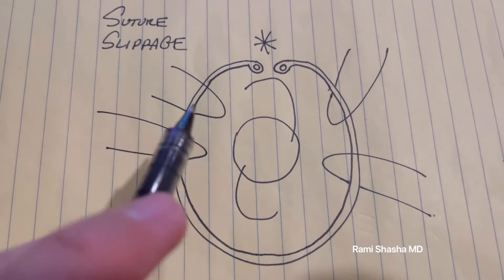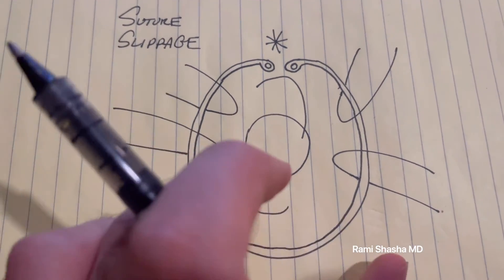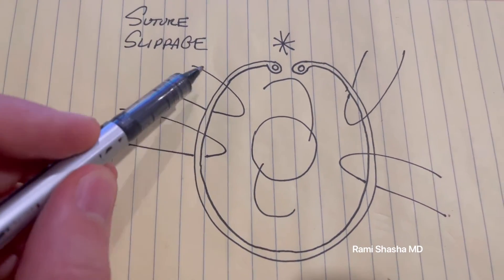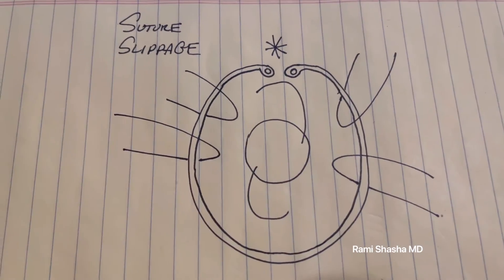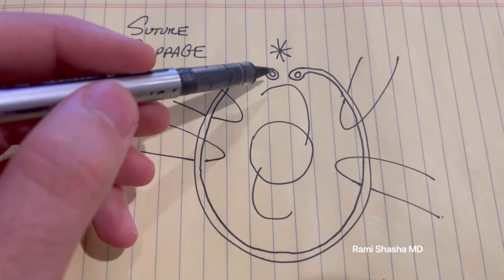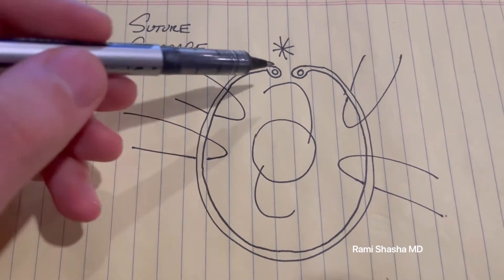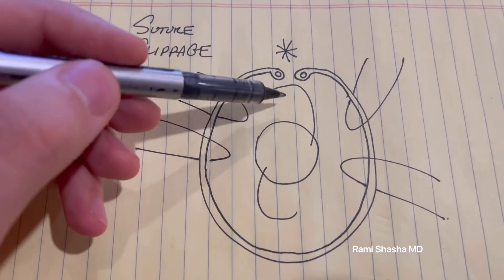If, for example, the complex is dislocated this way and you want to reposition it this way, you really have no issues throwing a suture loop here, here, here, here. But don't pass the suture loop where you expect the gap to be because it may ultimately pass through.